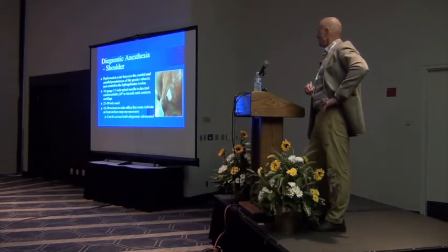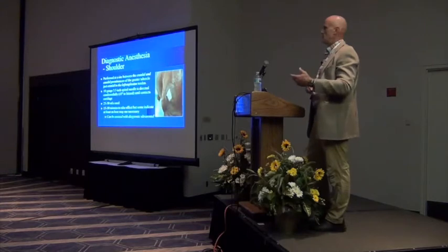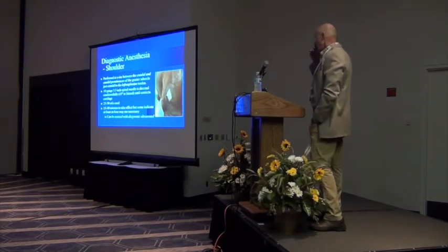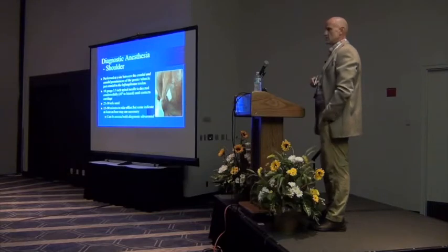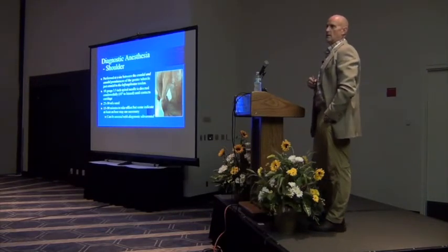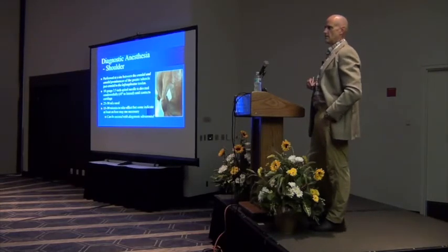Now this is how we used to do things, and I do spend a lot of time prepping them, and I like to use not always an 18 gauge needle, sometimes a 20 gauge needle, 3.5 inch spinal, and I'm going to try to drive it in a little bit off of lateral to medial, 45 degrees off of lateral to medial, and I'm going to try to use 25 or 30 cc's. And I can't tell you the number of times I said to myself, it's in the joint, it went easy. That doesn't cut it anymore. I think you need to know that you're in the joint.